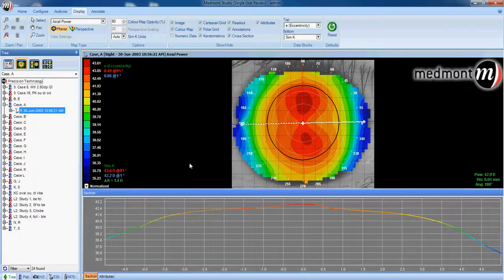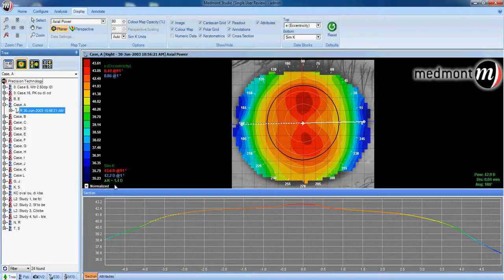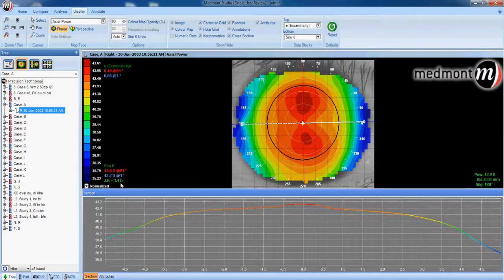Once we do that, you can analyze these topographies a number of different ways. The first way we might do so is to look at the SIM-K readings. This is our keratometry readings as determined by your MedMond topographer. In this case, the flat K is 42.2 and the steep K is 43.6. The flat K is along axis 1, steep K at axis 91. We can also see that this cornea has 1.4 diopters of corneal astigmatism.